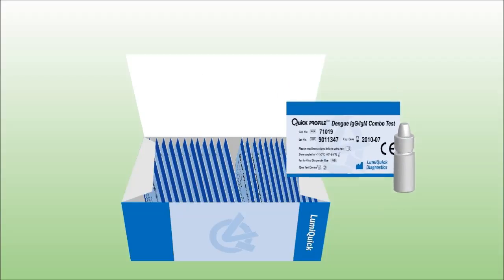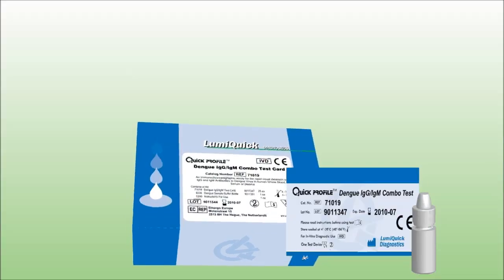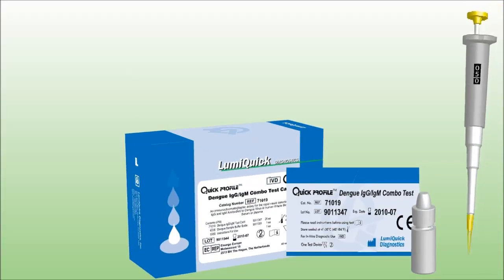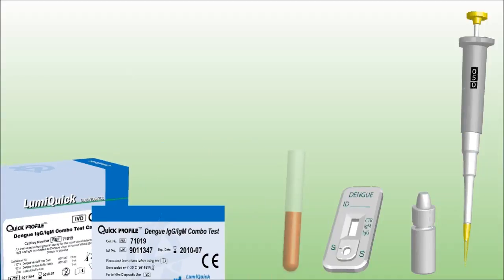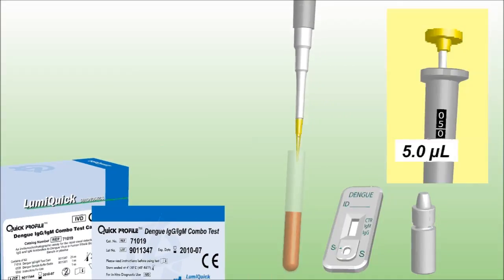This kit provided by LumiQuick Diagnostics contains 25 test devices and one buffer bottle. To use the test, bring the kit components to room temperature. Apply 5 µL of serum, plasma or whole blood to the S1 area indicated by the arrow mark.